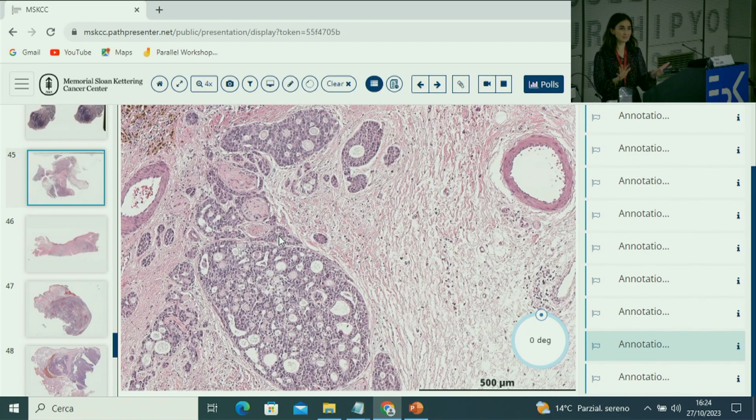And I learned since then that salivary gland tumors can look like anything. So especially if they have a high-grade carcinoma, although it's not common, it can be salivary gland, even if it doesn't show the typical morphology. And that happens often on biopsy. But on surgical material, if you put in enough sections and look everywhere, you're likely to find something helpful, like this area in this case. Okay.